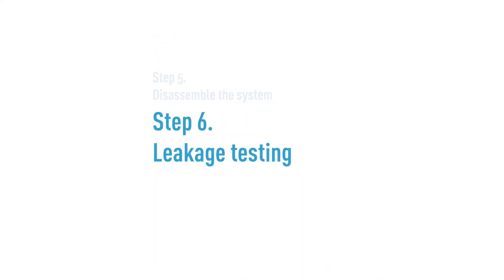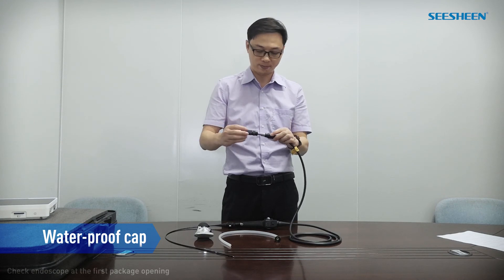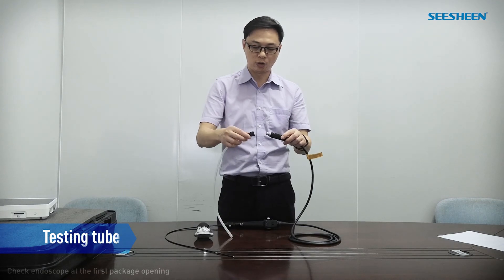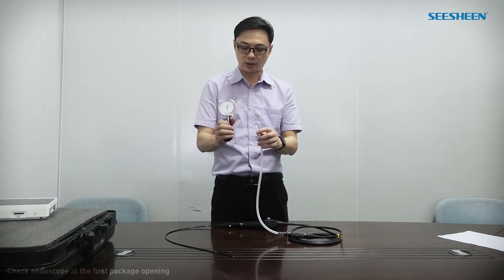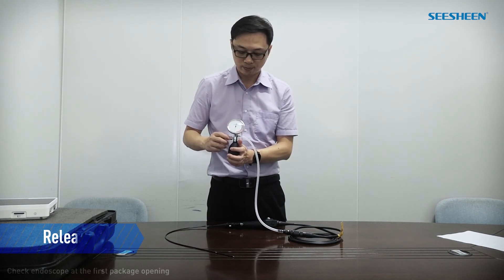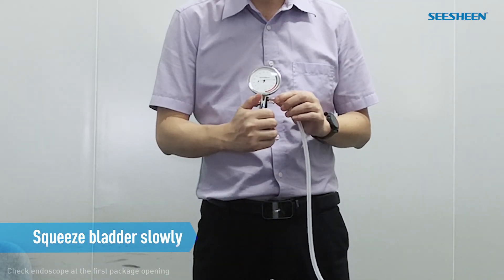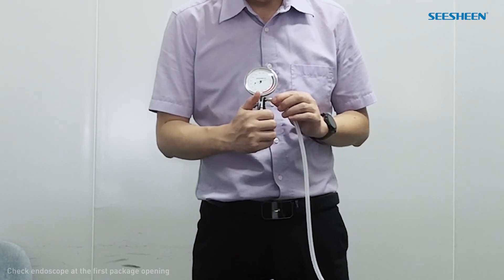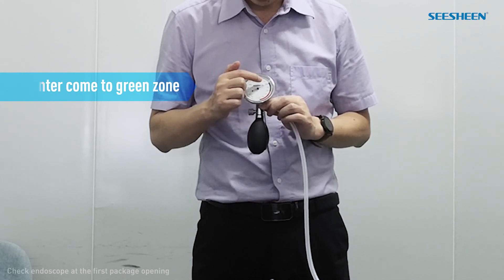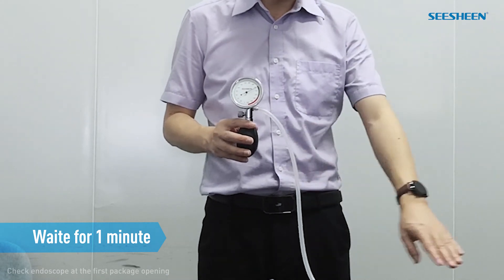Step 6: Leakage testing. We need to use this leakage tester to test the system. First, install the waterproof cap, then connect it up. Connect to the leakage tester. Remember to release the valve to make the needle return to zero, then lock the valve and squeeze the bulb slowly. After several times, the pointer comes to the green zone, which is the value between 200 and 240. Then wait for one minute, because the pressure needs some time to go through all pipes.